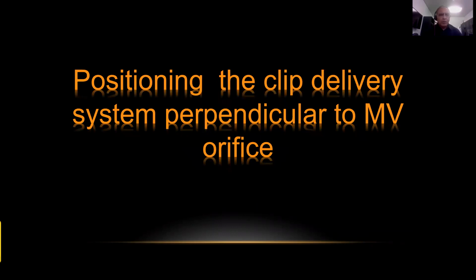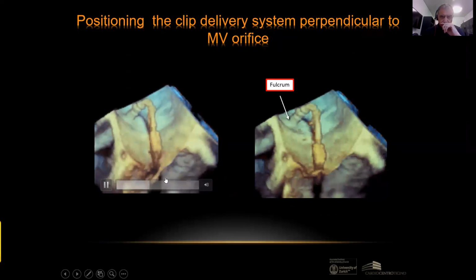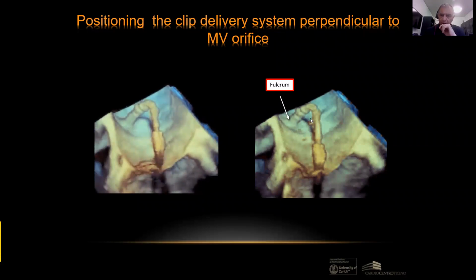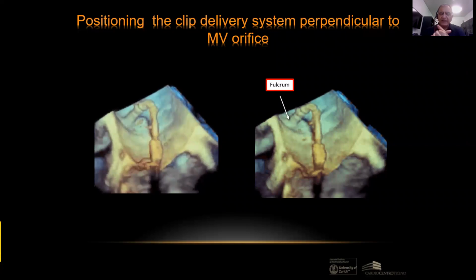Well, one of the most important things is the position of the clip delivery system perpendicular to the mitral valve orifice. It has to be perpendicular, because otherwise, if you are oblique in this way or this way, the grasping could be very difficult. In these cases, we can use 3D echocardiography. When you use 3D echocardiography, you know the fulcrum of the catheter is in the interatrial septum. So the interatrial septum makes the catheter very stable.